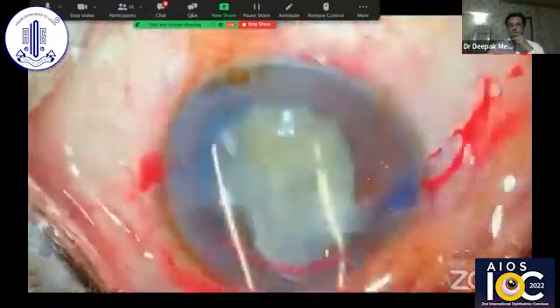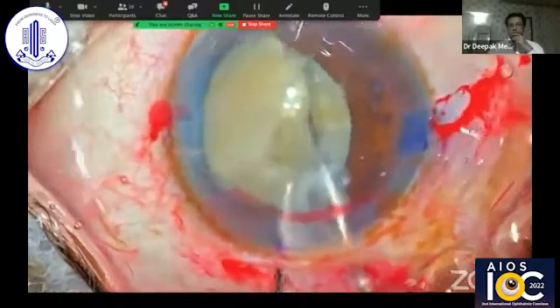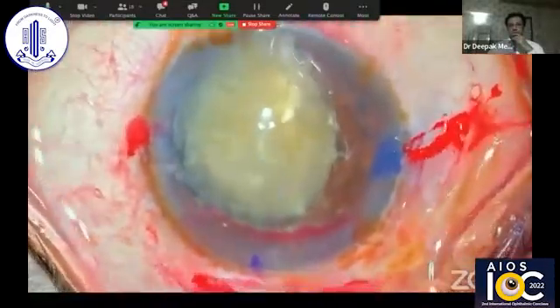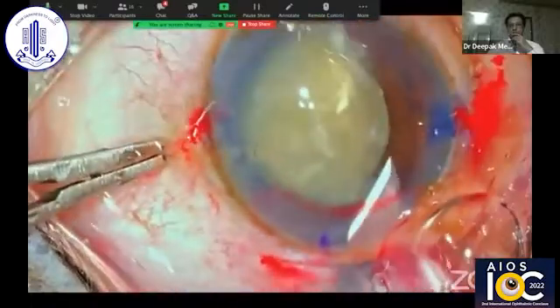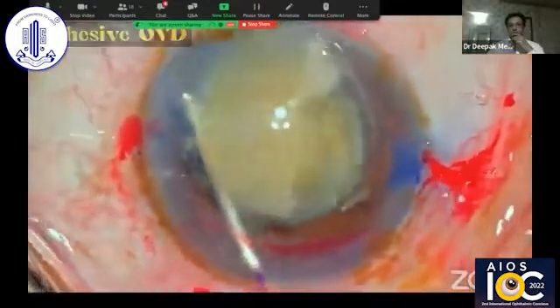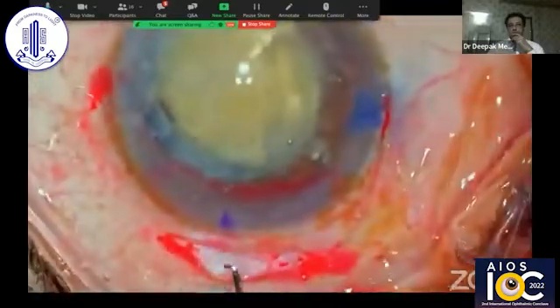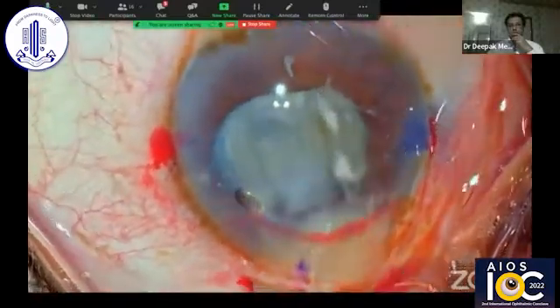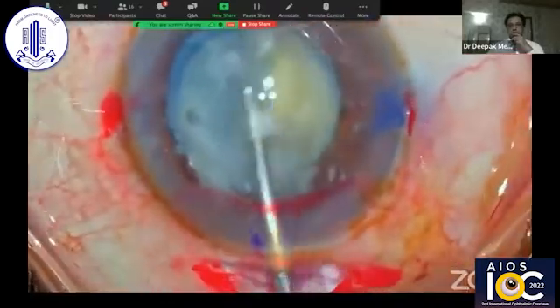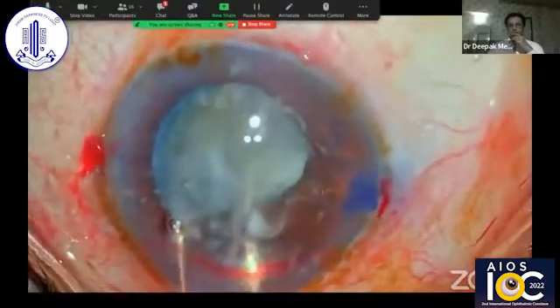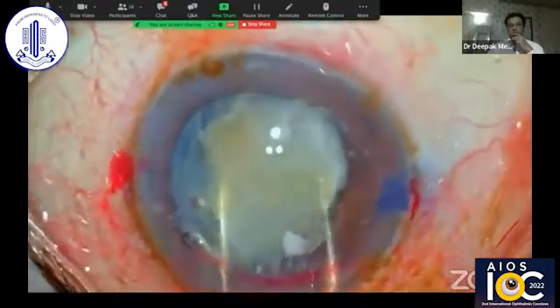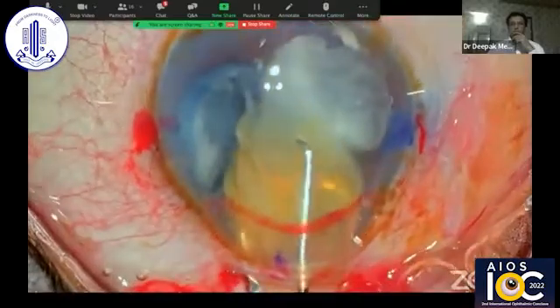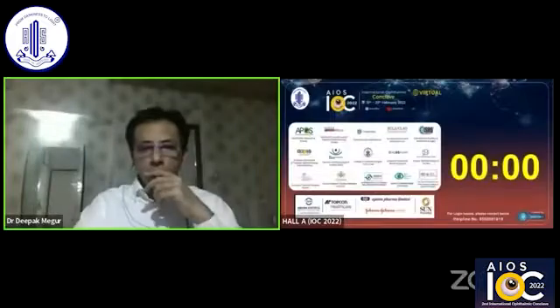There is a lot of epinucleus and lens matter which hampers visualization, so we need to be conscious of that. Using a little bit of viscoelastic to flush it away helps us see again. To be on the safer side, I'm just trying to enlarge the incision slightly. Under the cover of cohesive OVD, using the phaco sandwich technique — that is, using the vectus and the dialer — the hemi-nucleus is gently brought out. Care must be taken that the cut surface of the hemi-nucleus should not touch the endothelium, as that is the roughest part and will traumatize it. The dialer presses the hemi-nucleus down so the rough part is away from the corneal endothelium. Similarly, the second hemi-nucleus is manipulated out of the bag and expressed out using the same phaco sandwich technique. Thank you for your attention.